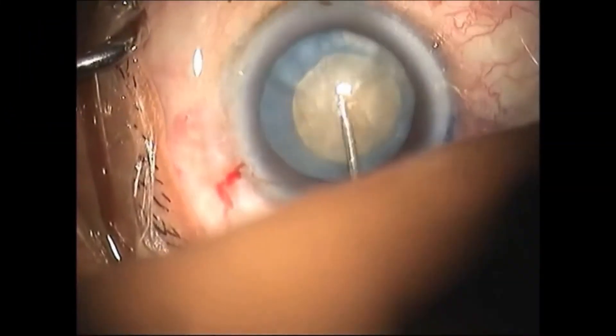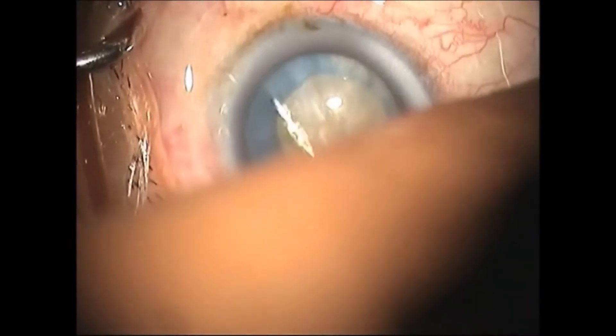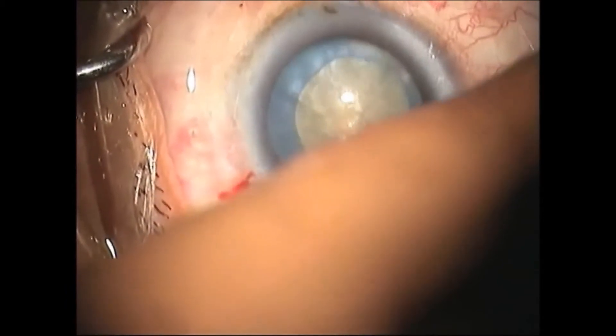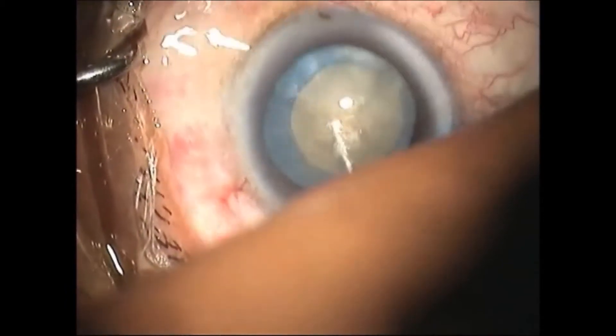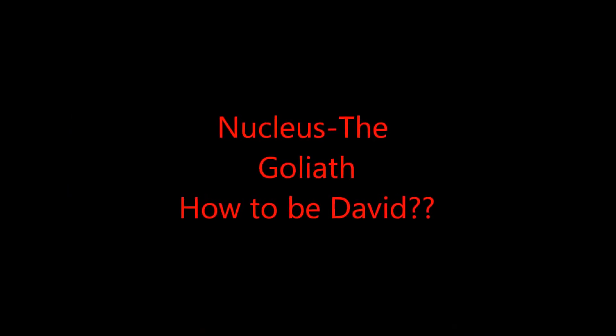The posterior capsule is thin in mature cataracts. Hence, hydrodissection must be tailored to multiple small, gentle injections of BSS with constant decompression of the nucleus.